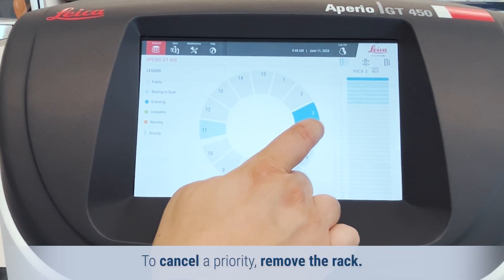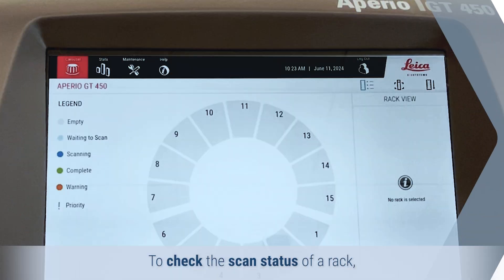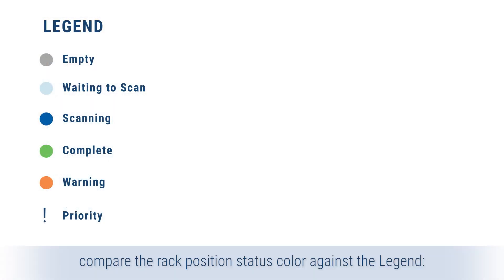To cancel a priority, remove the rack. To check the scan status of a rack, compare the rack position status color against the legend.